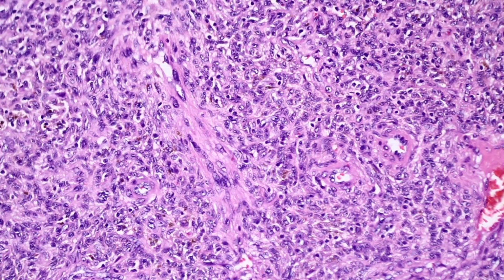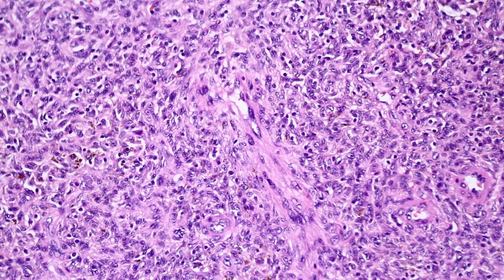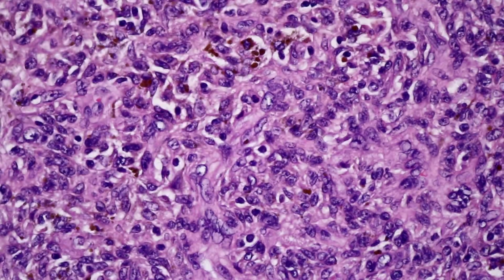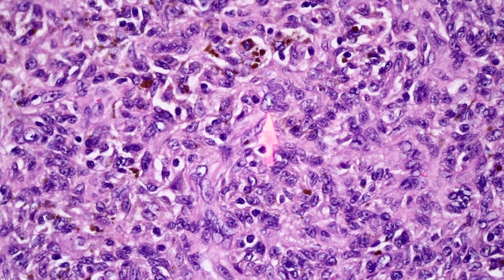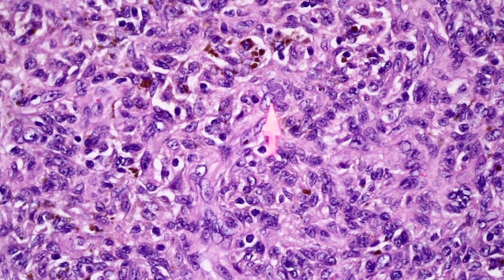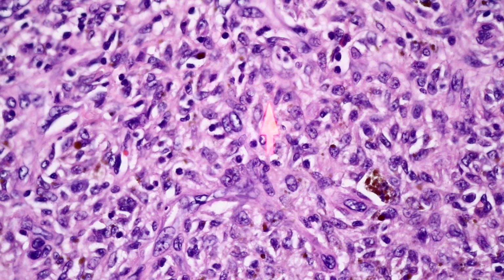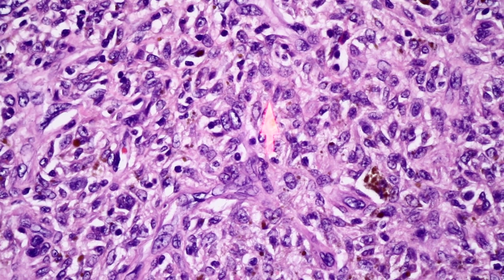Cytologically, these cells are somewhat atypical. They're kind of hyperchromatic. They're large and plump. Look at some of those nuclei. This one's not quite as hyperchromatic, but it's a pretty big oval to round nucleus. There's some variation from kind of smaller cells to larger cells, so basically there's some degree of pleomorphism here. These features are totally acceptable and in fact common in dermatofibromas.